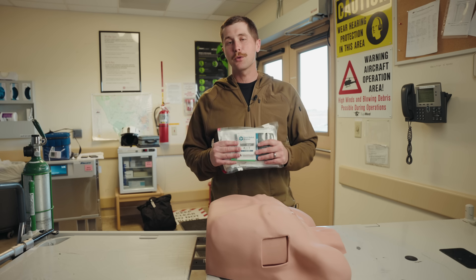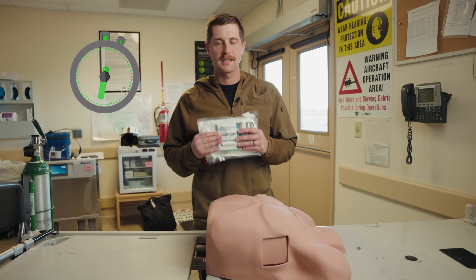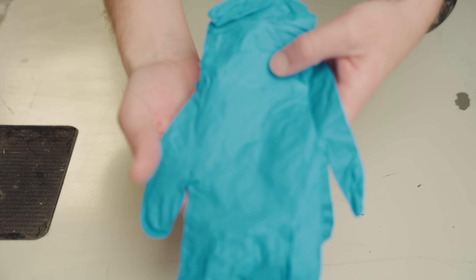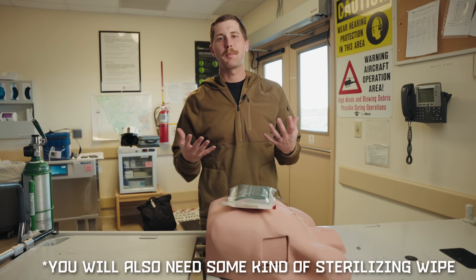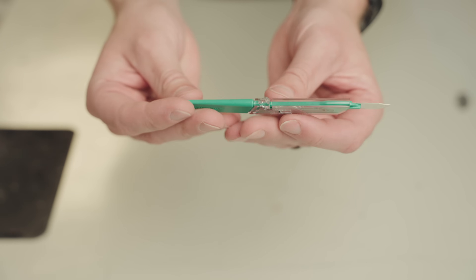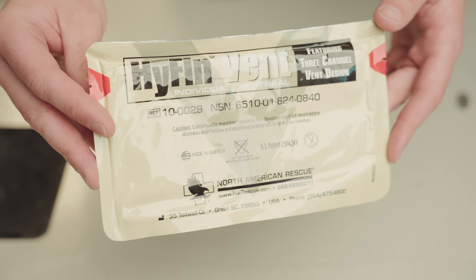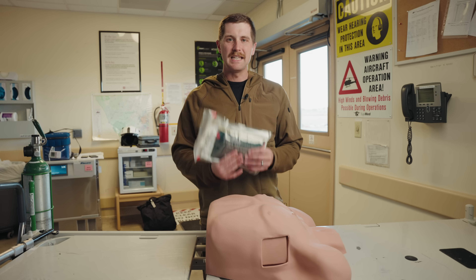Now that the background's out of the way, let's talk about the procedure itself. A finger thoracostomy can be performed very quickly — in under 20 seconds when you have enough practice. For this procedure, we only need a couple things. First and foremost, we need appropriate PPE: gloves and preferably some kind of face mask, because it is possible for blood to spurt and get us in the face, especially if this is a hemo-pneumothorax. Next, we're going to need a size 10 scalpel, curved Kelly forceps, and then some kind of occlusive dressing — I recommend a chest seal, and a vented chest seal is even better.